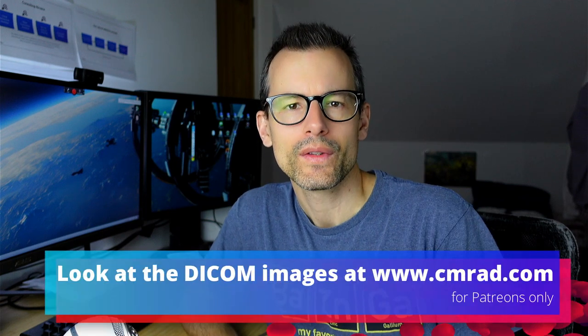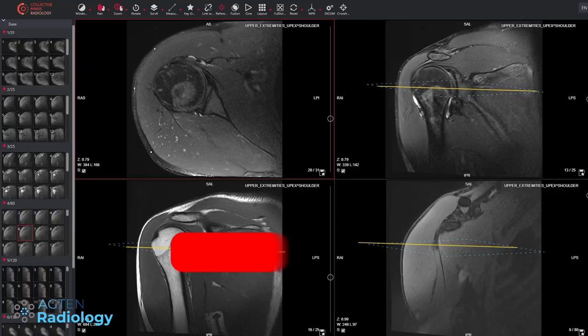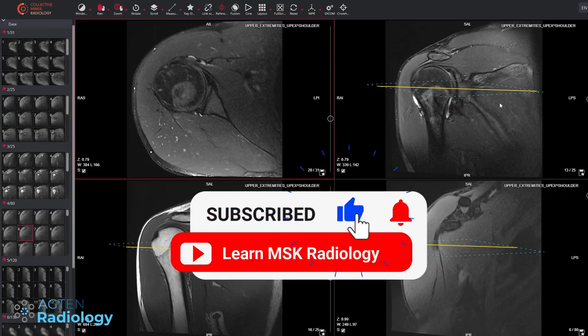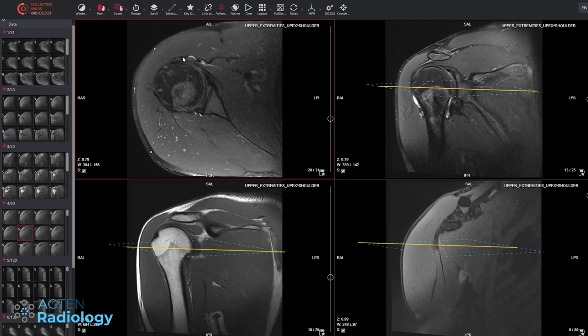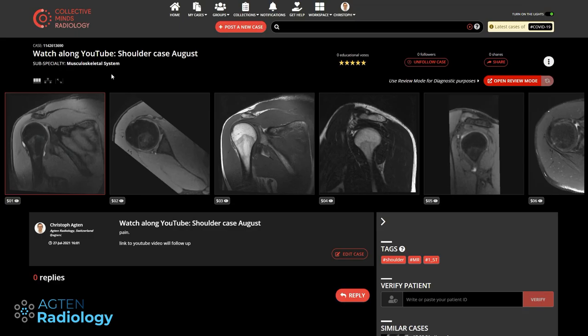In this week's video I will talk about a shoulder case that you can follow along over on Collective Minds Radiology if you are a Patreon. If you're not a Patreon you can still watch this video here on YouTube and follow along when I scroll through. Patreons have the opportunity to go through some cases on their own before I show the video, to train their eye and have a better learning experience.